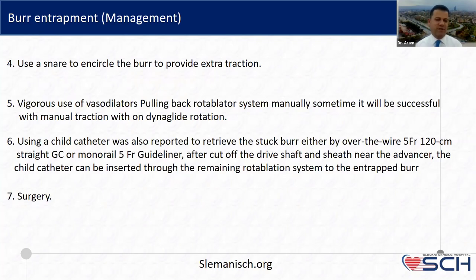And there is a special technique, a very long one, using a child catheter. You are going to take another catheter. We are going to cut the drive shaft of the rotor system, and you are going to take a 5 French guide catheter. It will act as a child catheter, child and mother, and you try to pull the rotor system inside this mother catheter in hope that it will give you some force. It's the same mechanism as the GuideLiner. We use the GuideLiner to give us support during PCI for difficult cases, or when we cannot cross a calcified lesion. This is the same story as the GuideLiner.